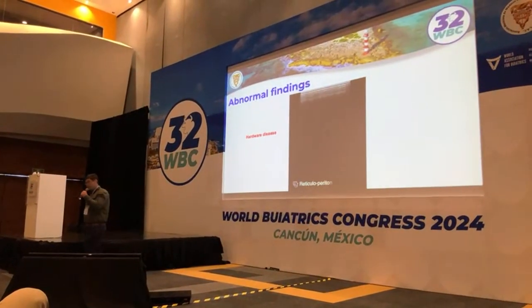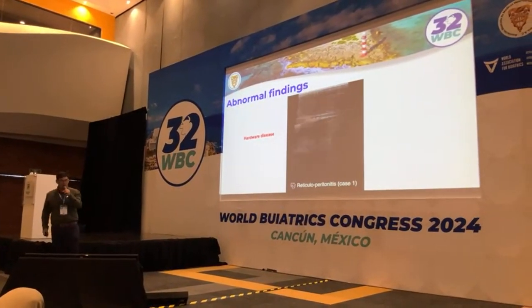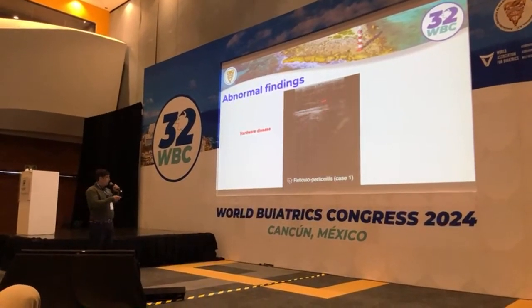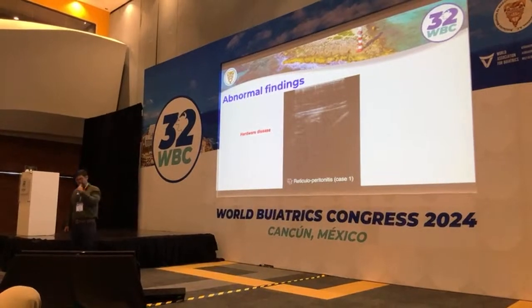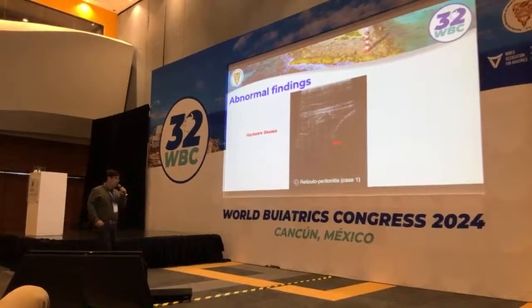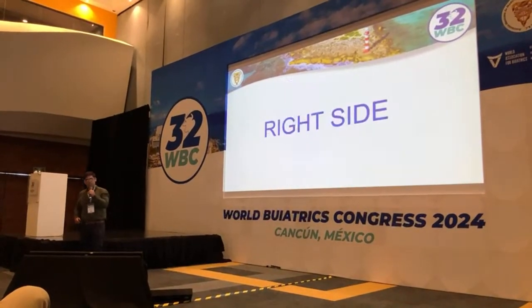The most important abnormal finding in that part is hardware disease. So you'll see fibrin, fluid, and sometimes you will see abscesses.